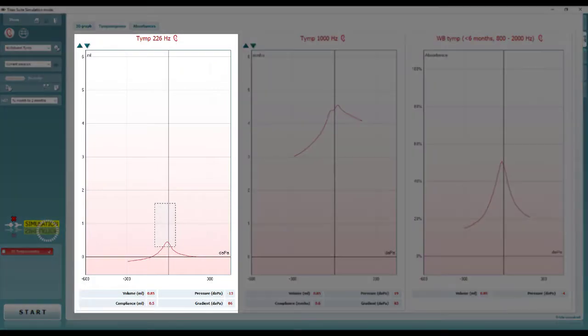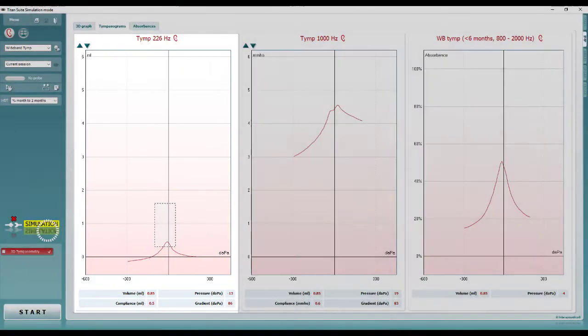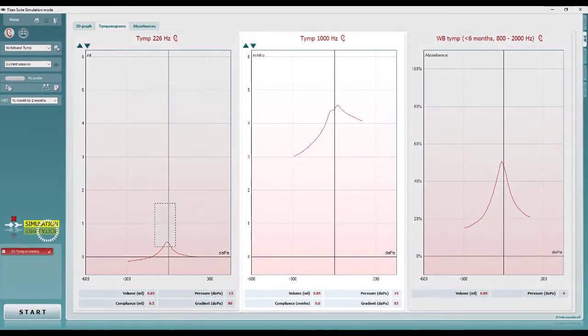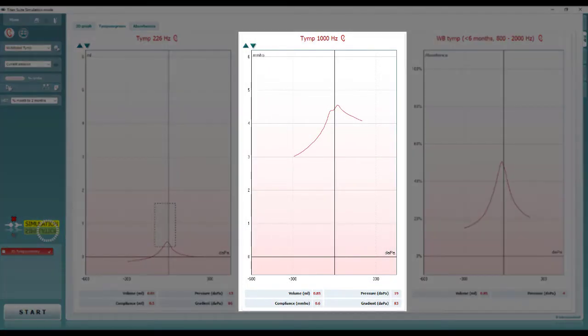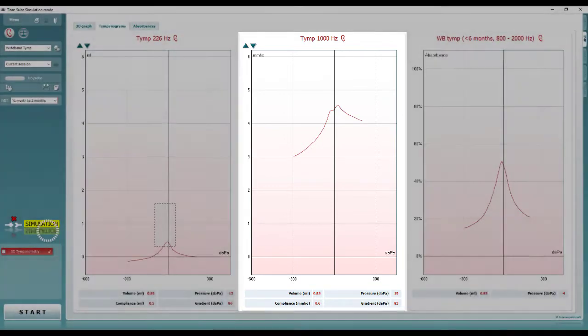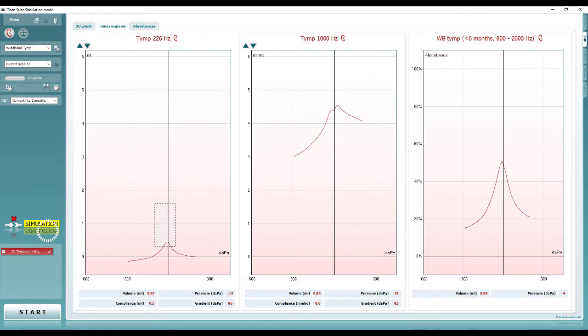By performing wideband tympanometry, you will also have the 1000 Hz probe tone reading, performed within the same measurement, which you can refer to if testing infants under the age of 6 months.